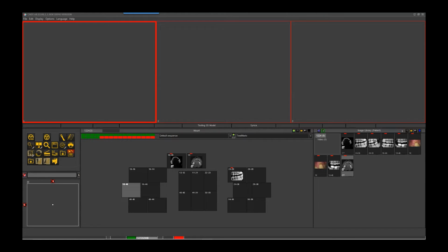Yeah, and one thing HIPAA requires is knowing where your images are stored. And a lot of people, when they have a cloud program, say, well, I don't know where they're stored. They're in the cloud somewhere. Yeah, they're at a server farm somewhere. Not sure where it's at.